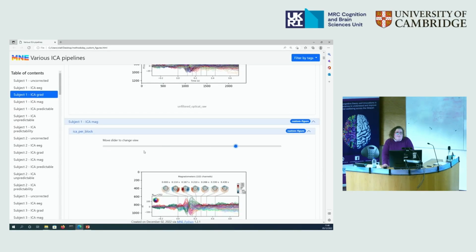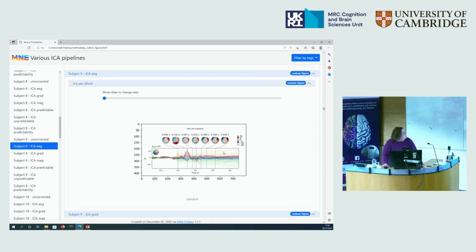However, unfortunately, we have not come up with a full pipeline yet, because what works for some participants does not work for others. So for this participant, for example, by applying the same pipeline, the data basically don't change that much. Both the corneoretinal dipole and the spike potential are still present in the data. So if anybody of you has worked on similar types of problems, I'm very happy to talk and hear other suggestions on other possibilities on how to clean this type of data with ICA.